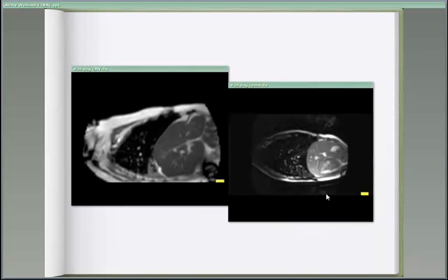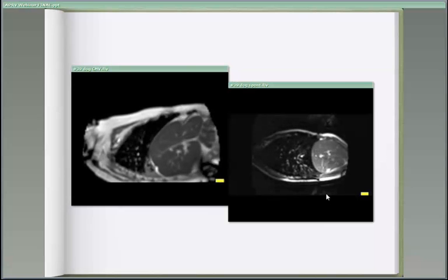I also want to point out how the liver is squeezed by the diaphragm, and of course this assists in preload and is why cardiac output might be improved by just simple spontaneous breathing. You actually squeeze all the blood out of your liver and improve venous return. That doesn't occur here, and you're more likely to get passive liver congestion, which is frequently a problem with mechanical ventilation.